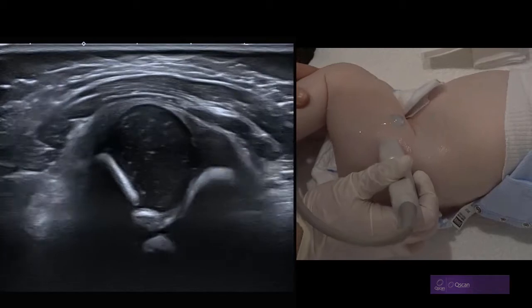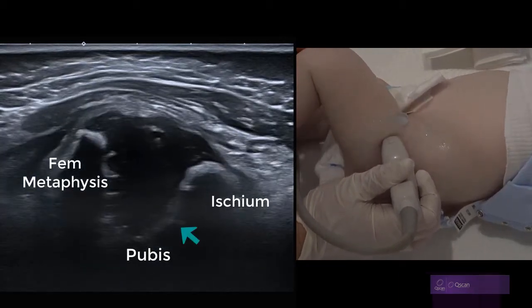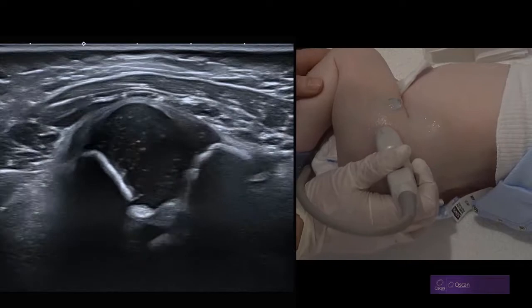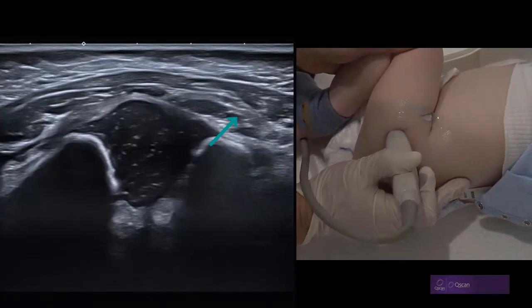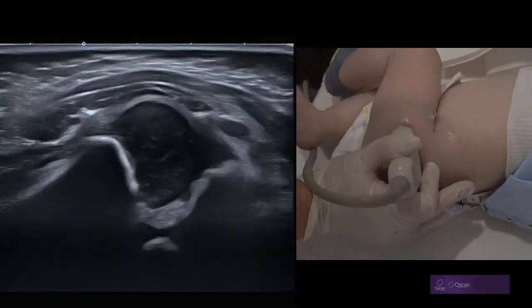Then by narrowing the joint in adduction, we can assess for a hip that subluxates out. We're looking at the depth of the acetabulum on adduction and how far the femoral head is from the medial acetabulum. Particularly if we add the Barlow stress manoeuvre — pushing backwards on the adducted knee — we're looking for slippage of the femoral head backwards over the ischium, to the right of screen, or away from the medial acetabulum.